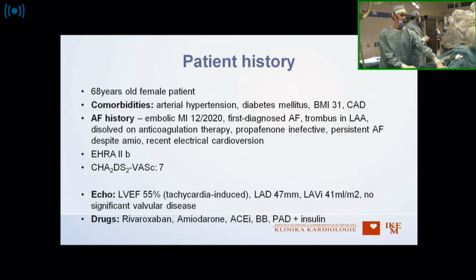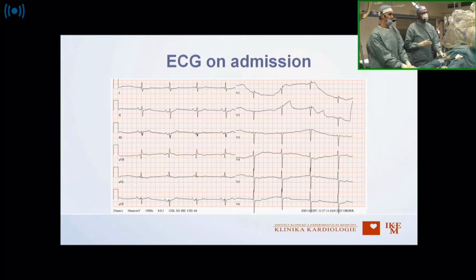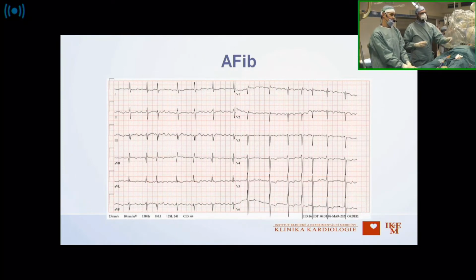Can we show the next slide, please? Okay. So this is the ECG on admission. We see sinus rhythm. And the next slide, please. This is her ECG with AFib. Okay, let's show the screen now, just to show you the anatomy of the atrium.